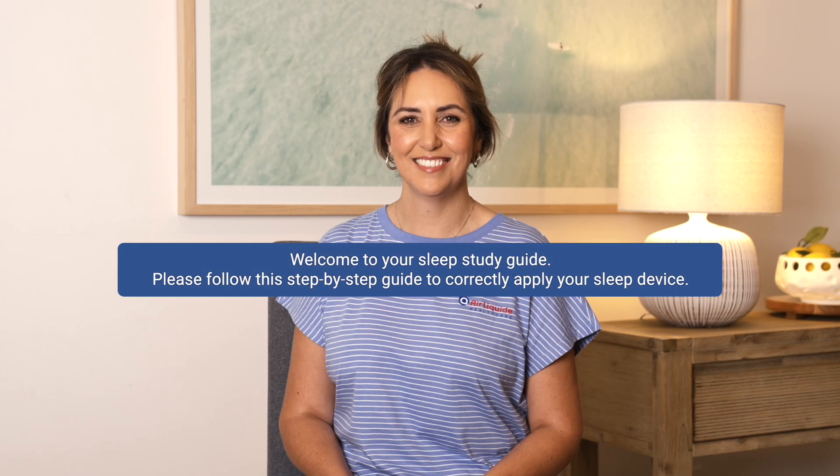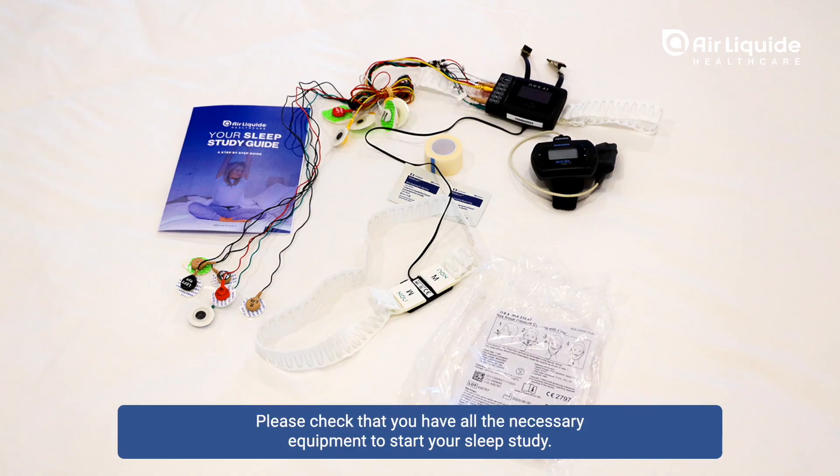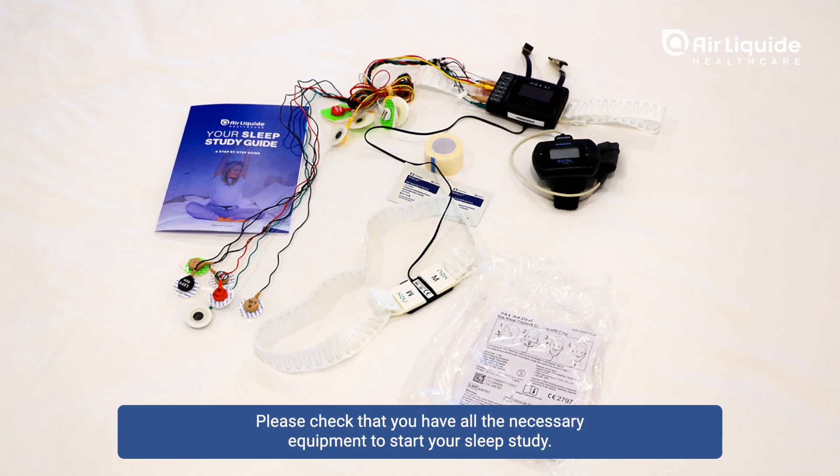Welcome to your sleep study guide. Please follow this step-by-step guide to correctly apply your sleep device. Please check that you have all the necessary equipment to start your sleep study.